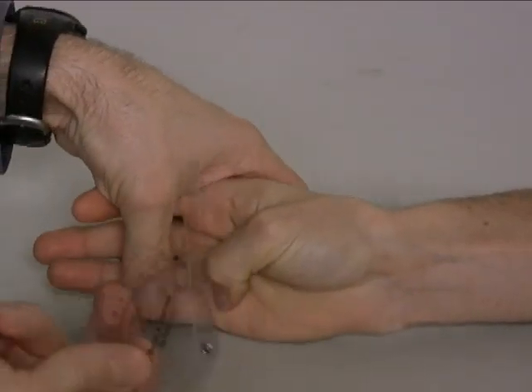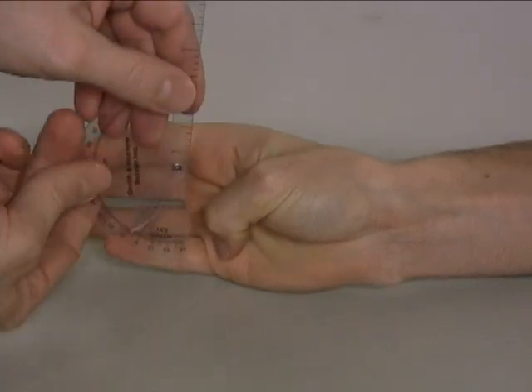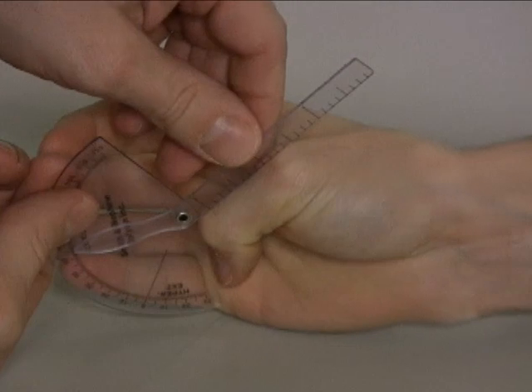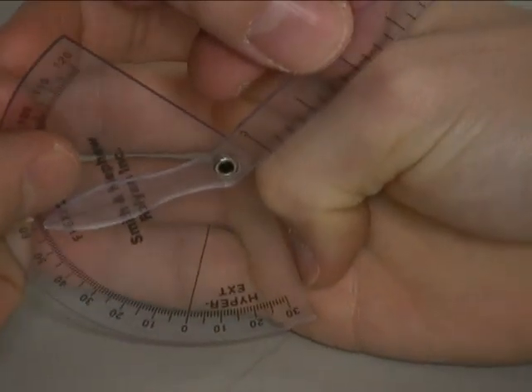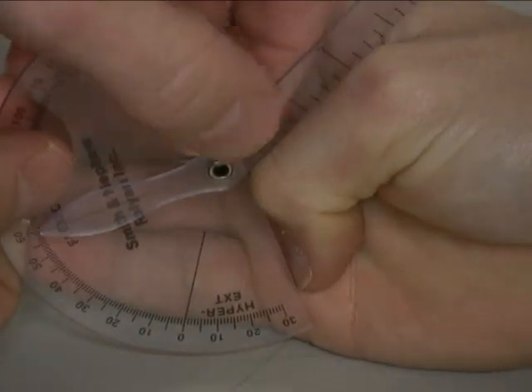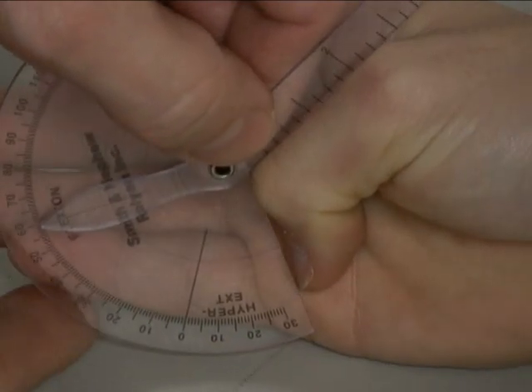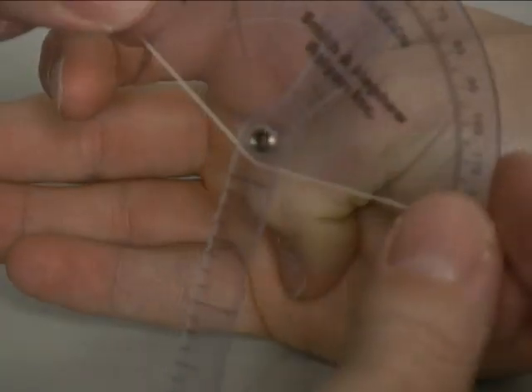The American Medical Association method for measuring thumb flexion is like this with the goniometer on edge and the moving arm extending all the way to the end of the nail. That's the key with the American Medical Association method. And using that method, we have about 60 degrees of flexion.